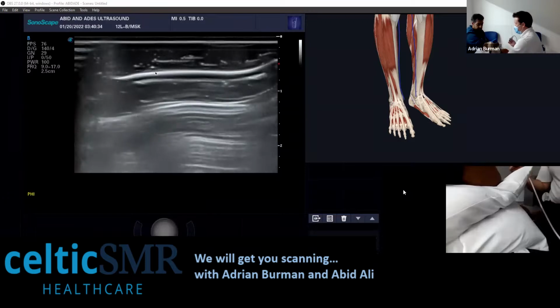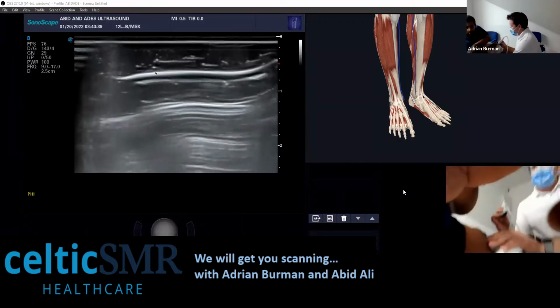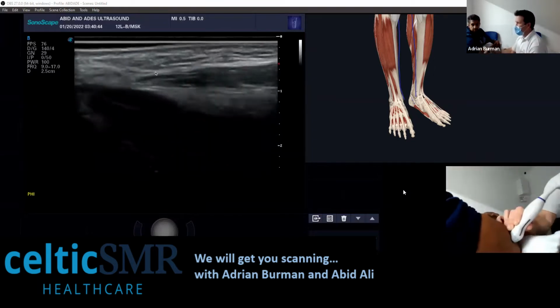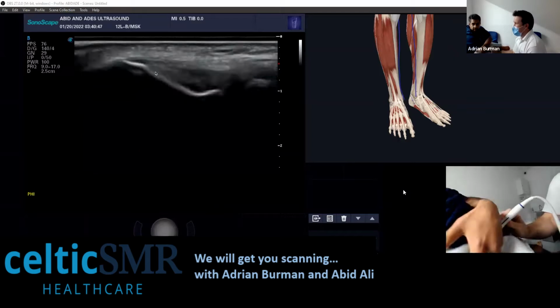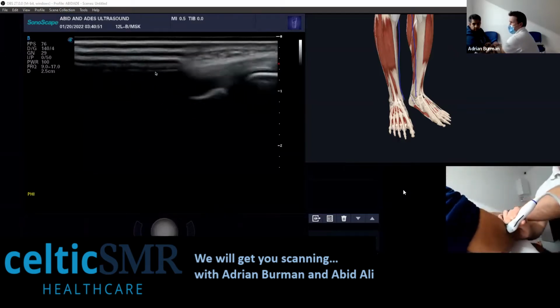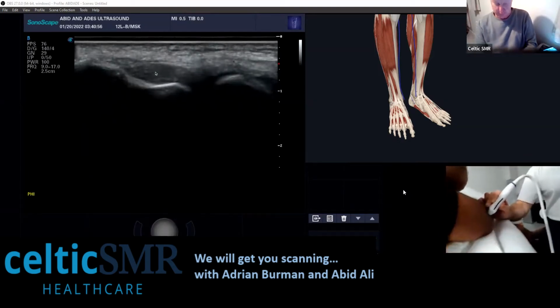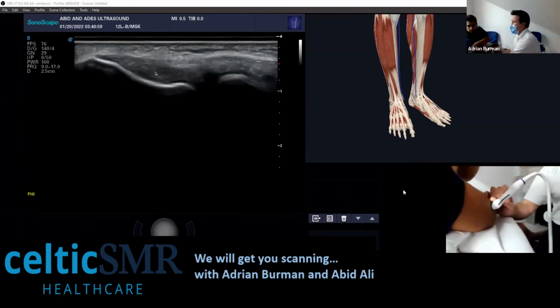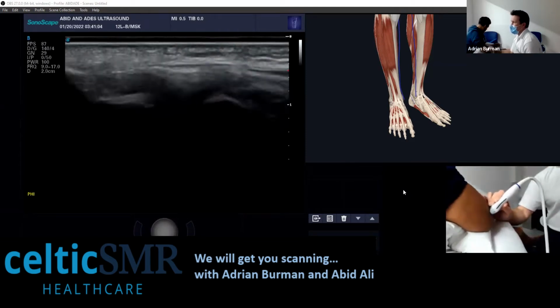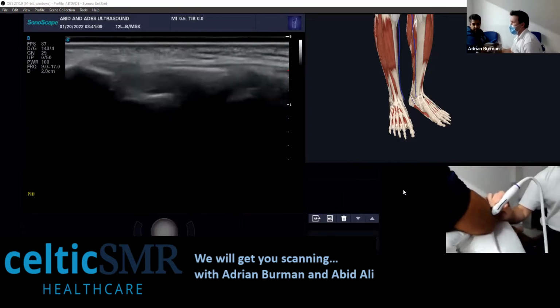So I tend to get the arm in this sort of position, and I just adjust the camera here. And I find the lateral epicondyle, and I just drop the probe straight down onto it there. And this is your pretty picture, as it were. There, and just remember your depth and your focus is all in it right. That's a good image there. I was just trying to give him a better picture.